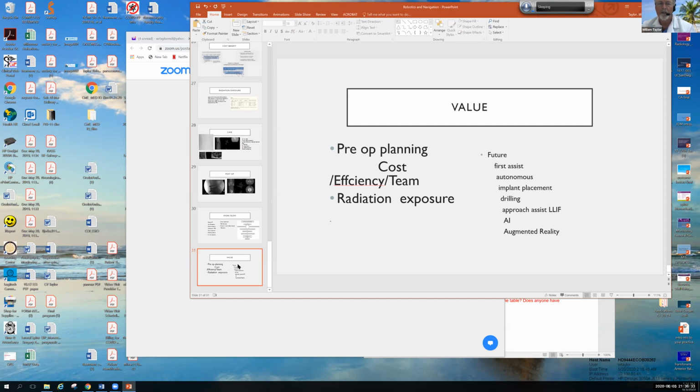And I have a concern that what we do is completely different and not predicated on the same outcomes that we have. The horrible case I think that Igor showed, where we had screws right through the spinal cord, that's not a typical case. Whereas if you have better outcomes in continence and sexual function, that's going to be something which people find really, really important. So that's sort of where we're at. And I think what we sort of do with the robot here, where we're at.